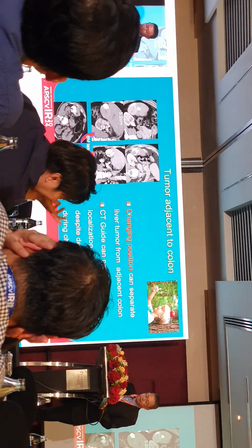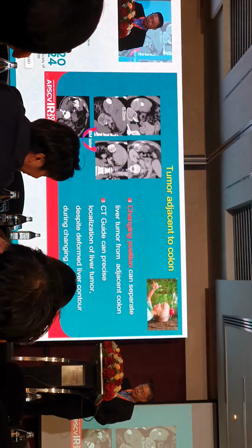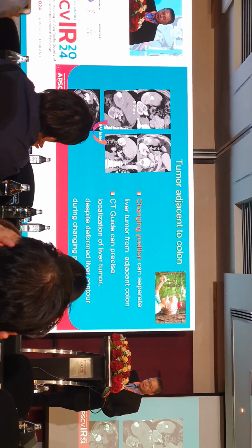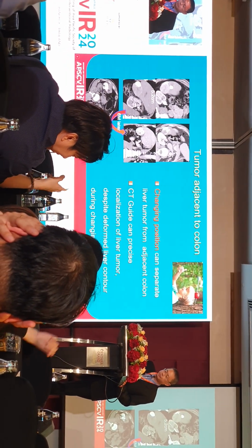Another lesion, which I showed before, is just adjacent to the colon. After inserting the ablation needle in the right side up position, I separate the tumor from the colon. After ablation, 6 months later, the tumor was completely ablated, smaller in size, and no injury to the colon.